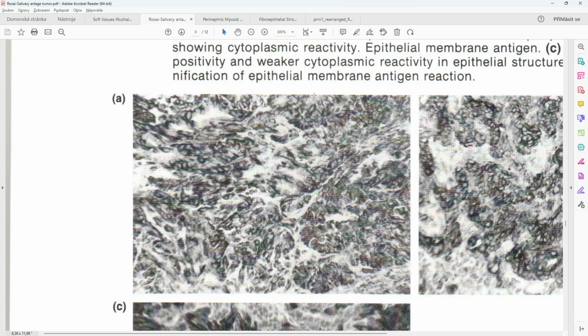And we tried to do genetics on these tumors because the retinoblastoma protein deficiency is very conspicuous, but we didn't find any genetic change in the retinoblastoma gene. So there must be some epigenetic change that we cannot diagnose by genetic means, just by immunohistochemistry.